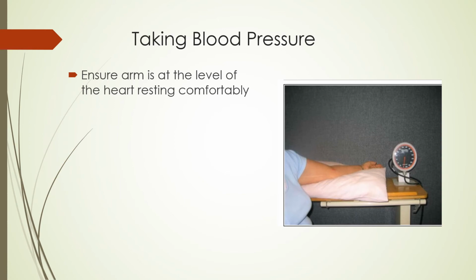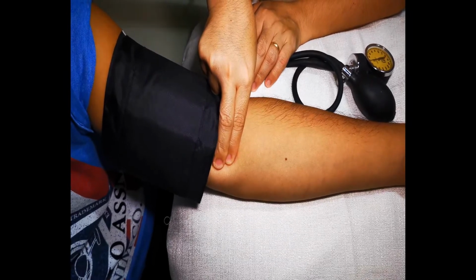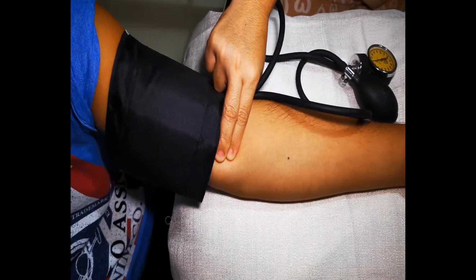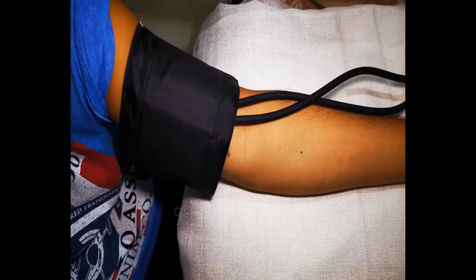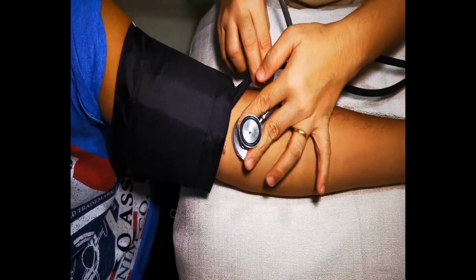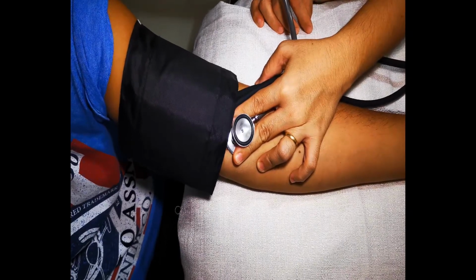In positioning the blood pressure cuff, first, you have to locate the brachial artery. Use your two fingers, your index and middle finger, over the center of your inner elbow, or it can be found on the elbow's front side. When you press lightly, you should be able to feel the pulse of your brachial artery. If you have difficulty locating the pulse, place the head or the diaphragm of the stethoscope in the same general area until you can hear the heartbeat.